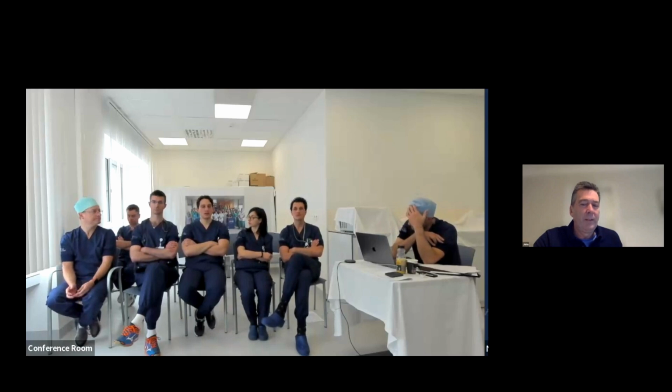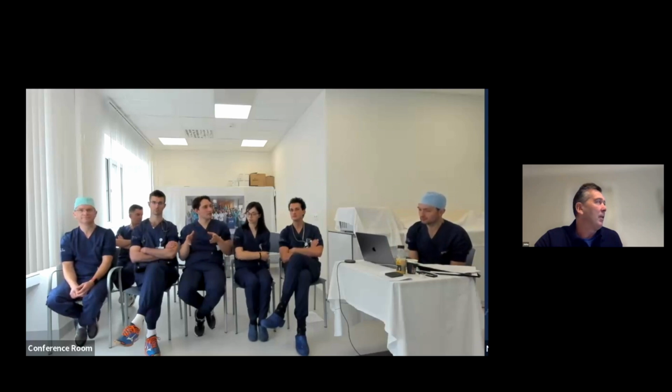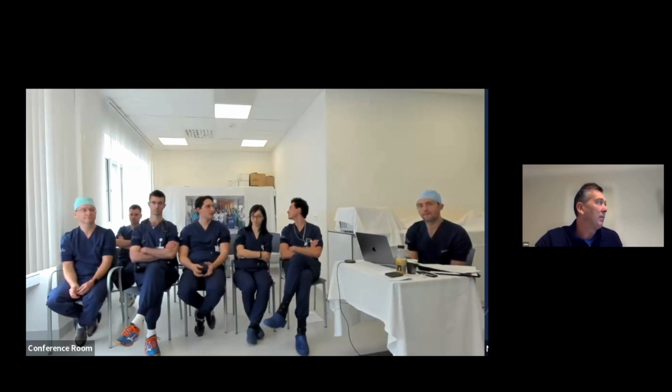I think that it's very important in this kind of cases to be systematic. And at the beginning, I was not having this approach, maybe because I was waiting for your request. But I think that it is very important, because when you enter a stomach that has this level of disease, if you are not systematic, you will definitely miss something.